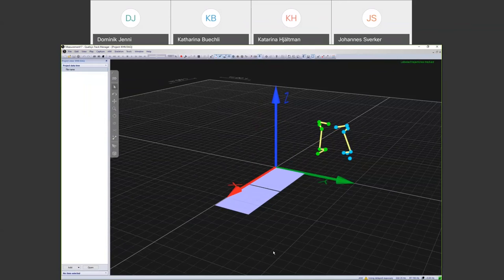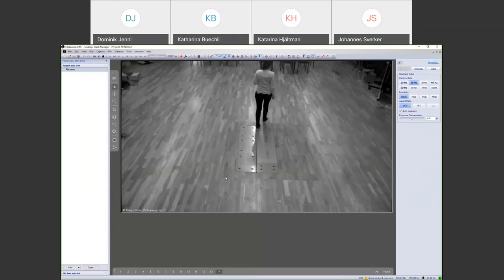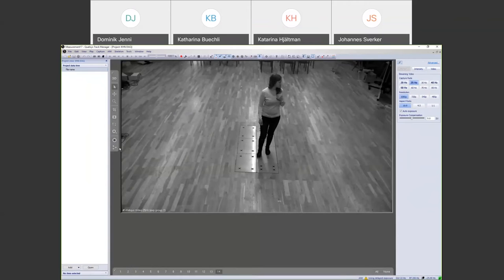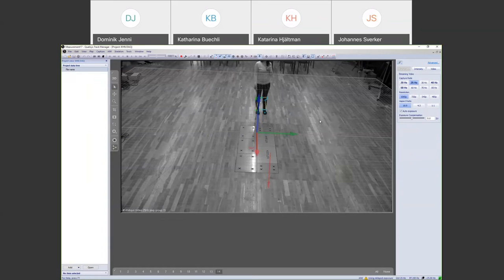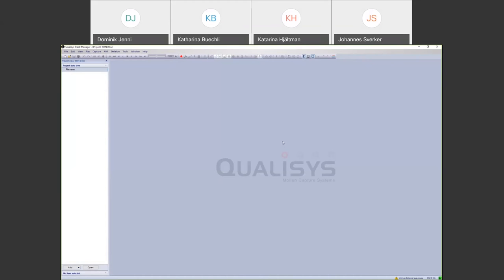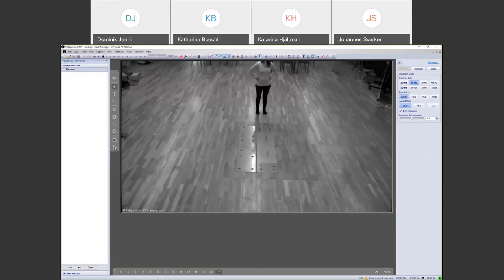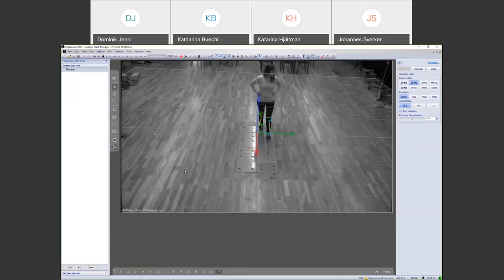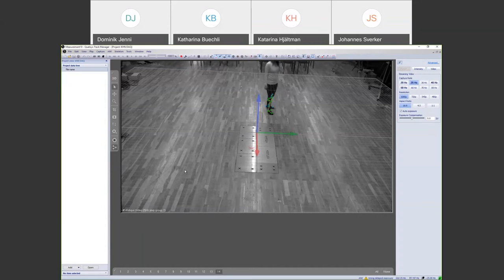The setup also includes two video cameras. Turning on the 3D overlay shows the force plate in the 3D world. When Katarina walks again, you get the overlay with the force arrow together with the synchronized video. The cameras are calibrated with the rest of the system and synchronized, so their position is known in the 3D world.